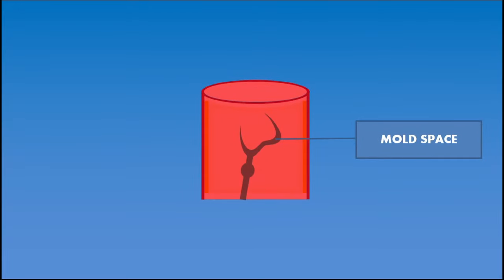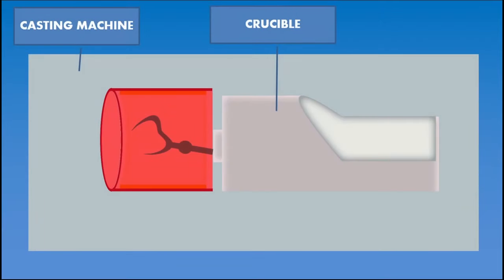At the end of the burnout process, there will be an empty space which was previously occupied by the wax pattern and sprue former. This empty space inside the investment is called mold space. Still, the casting ring investment setup is hot. It is transferred to a casting machine.